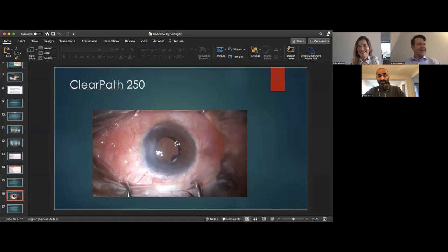So we actually go at the limbus, Maria, and we do use glue, and we close just fine. Instead of pinching the two sides together, we're actually going kind of like where you put your suture that you did. And it works okay, but we do secure the plate to the sclera with suture, which Nate doesn't do. So it just depends on sort of how you're mixing and matching things.